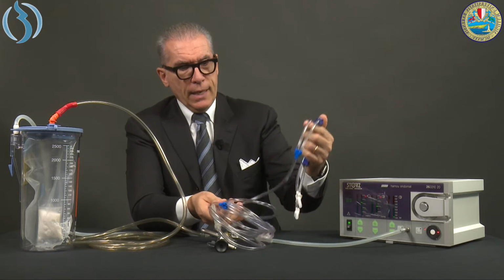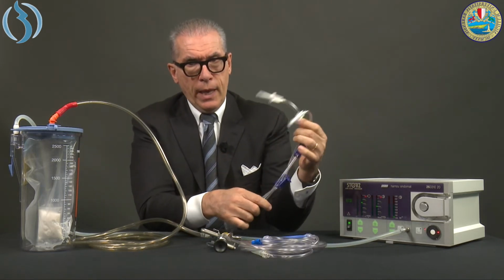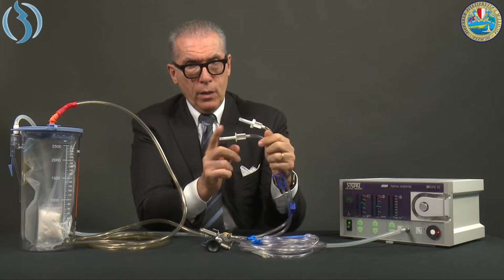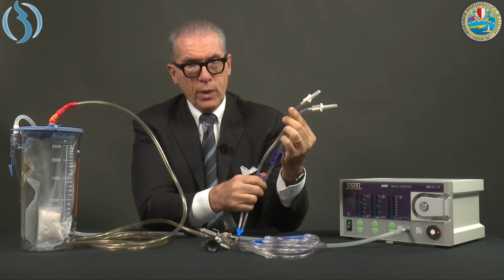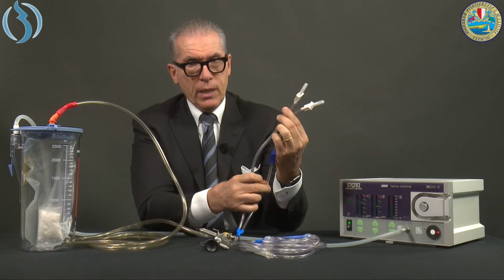So the first part goes to the bag, okay? And you can connect two bags at the same time. This is in order to reduce the time needed to change one bag for a new one. So you can keep one closed and the other open. As soon as one is getting to the end, you close it and immediately open the other one.